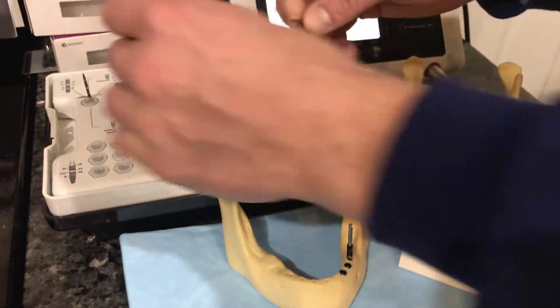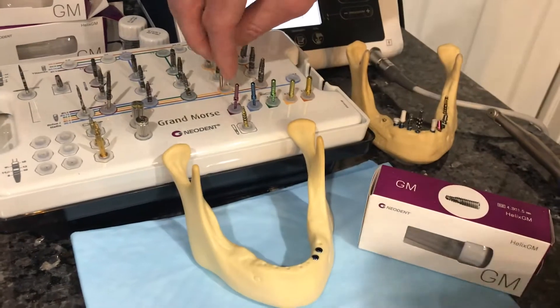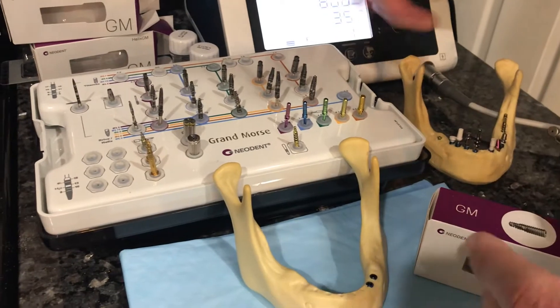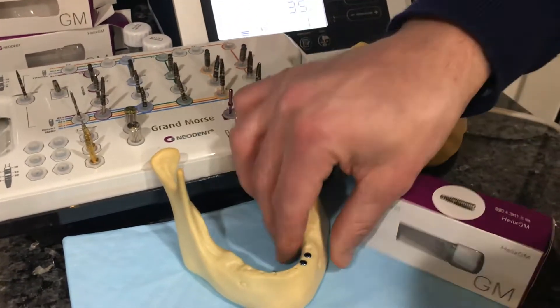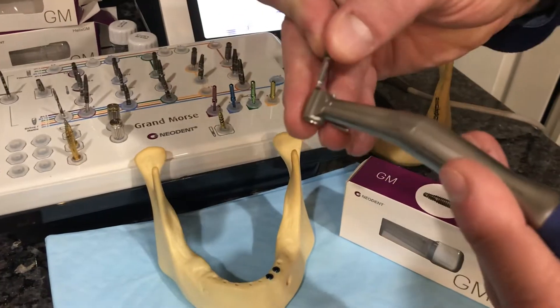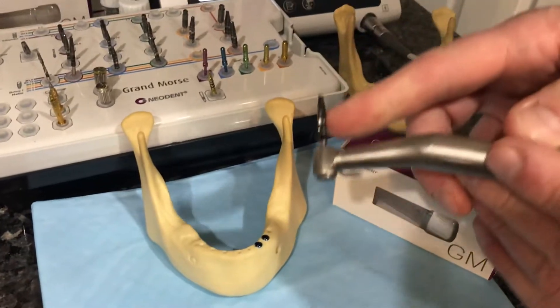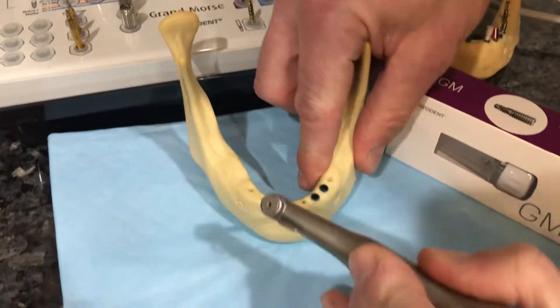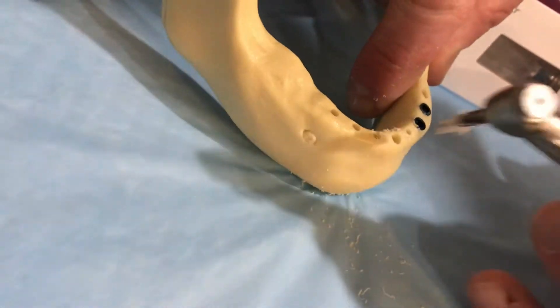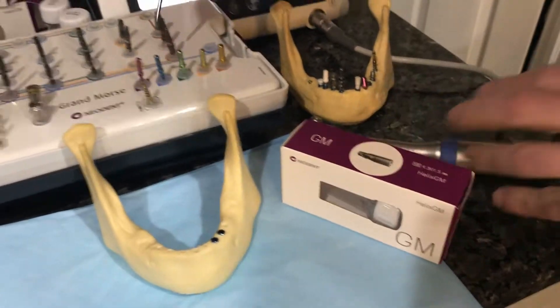A nice thing about this system is a lot of flexibility. In the event that we're in soft bone — say the posterior maxilla and I want to drastically undersize that osteotomy — I can do a 2.0 drill to full length and then take the 4.3 diameter drill and just open up the top of my osteotomy a little bit.